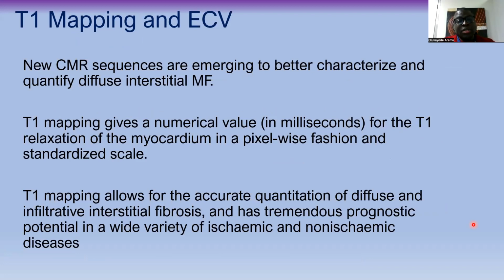Okay, let me just state this emphatically now. So LGE is very good. LGE is good, established, with good prognostic and diagnostic features. It can show you myocardial infarction. In fact, anywhere in the myocardium, it is good for focal fibrosis. But you see, there are some diseases that come with diffuse myocardial fibrosis.